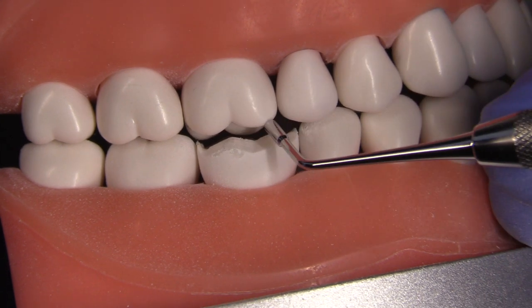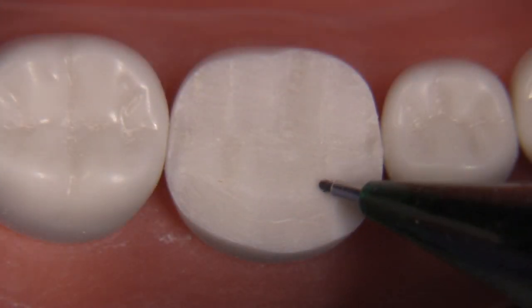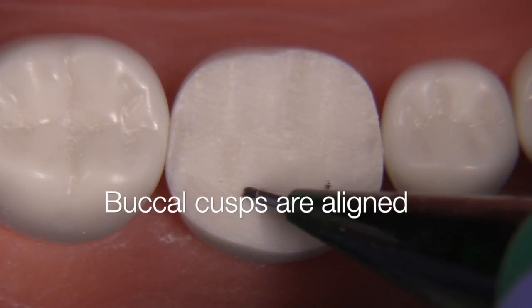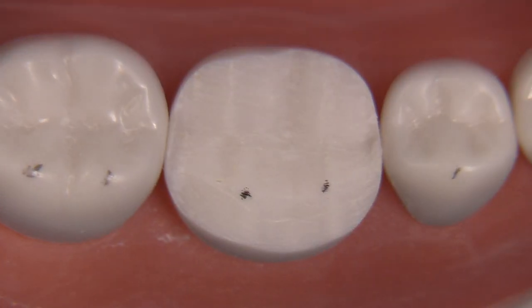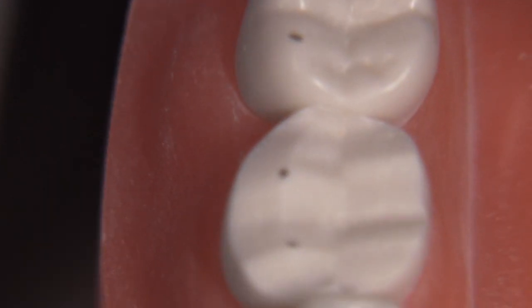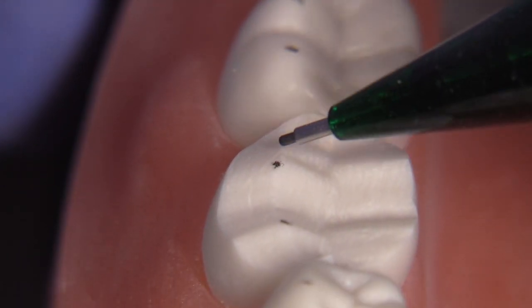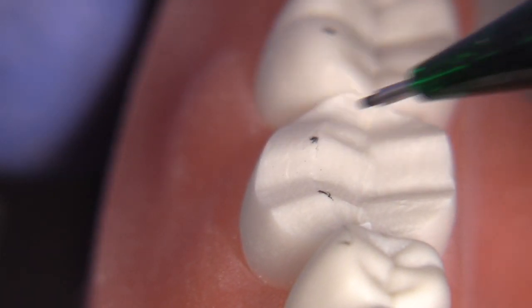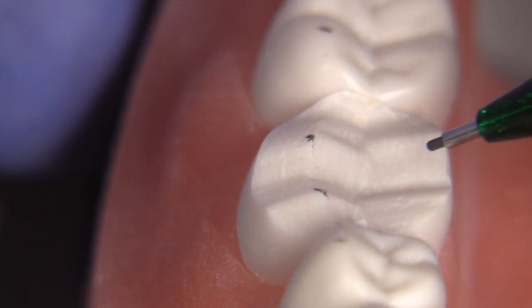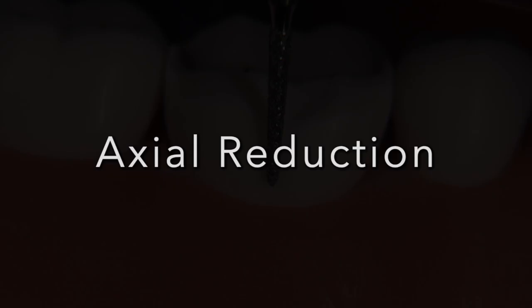After smoothing we'll probably have closer to 2 millimeters. I like to make a few dots on the buccal cusps after finishing the A, B, and C planes, because if you've done them right the buccal cusp tips just line up with unprepared teeth distal and mesial. Just make sure the A plane and C plane are parallel to each other. Why don't we move on to the axial reduction.